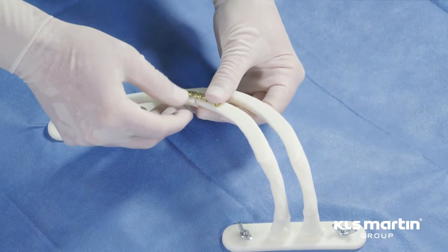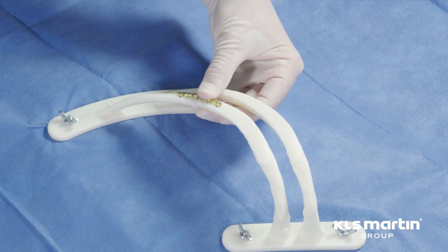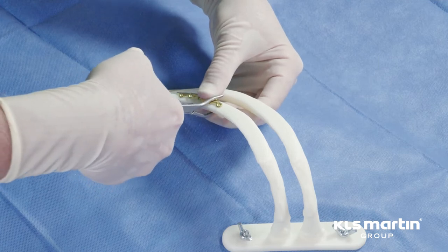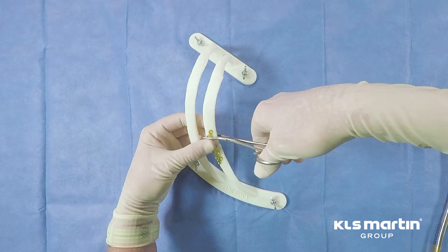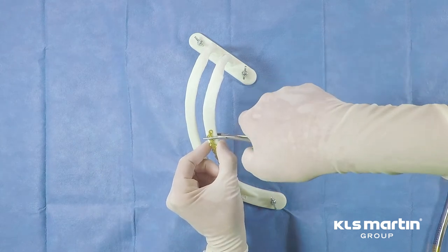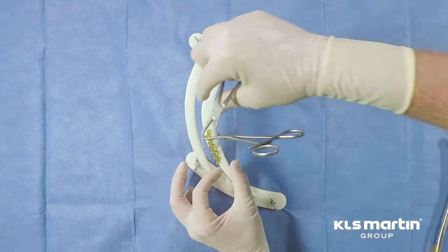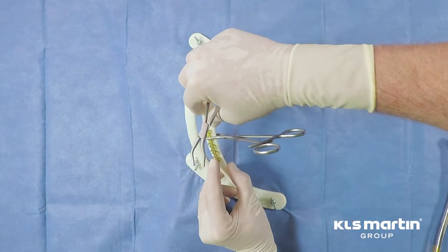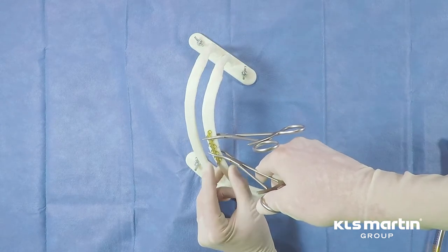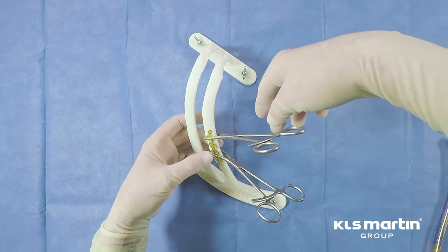After precise reduction of the fracture and tailoring of the plate to fit the anterior rib surface, the plate should be clamped in place. There are a variety of clamps available. This is one of the simplest and most versatile. One must be careful not to crush the rib. It's not uncommon to have to make adjustments in the orientation of the plate after the clamps have been applied.